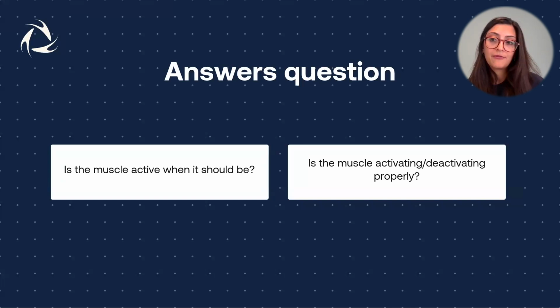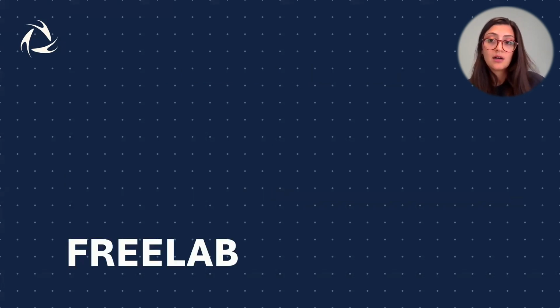Although, if the goal of the therapist is to know if the muscle is active when it should be, and also if it is activating or deactivating properly, then it's fundamental to have a way to identify some sort of time events that characterize the movement in which the muscles are involved. So this need leads to the introduction of our last technology that we're going to see today, which is the Freelab system.